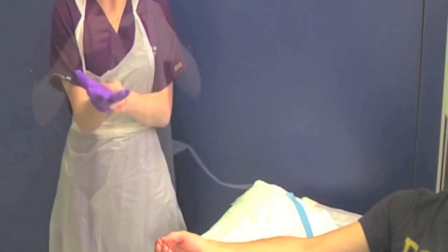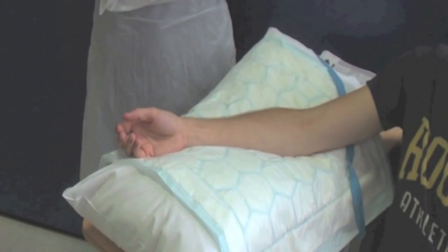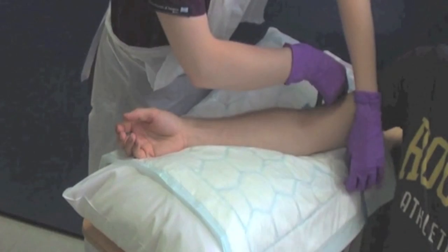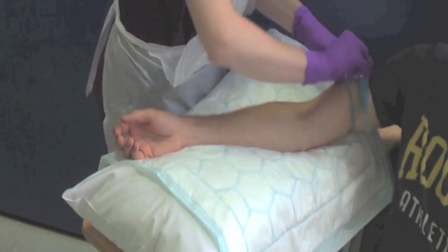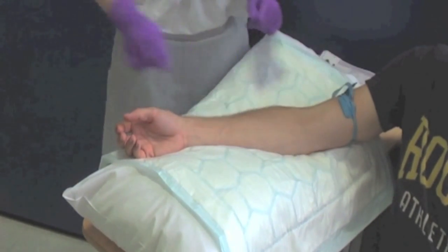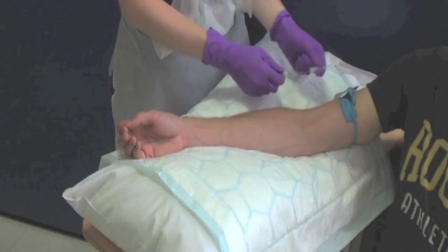Apply the apron and gloves. Reapply your tourniquet to distend the vein. Do not repalpate the cleaned area of skin. Pick up the first blood bottle and unsheath the needle.